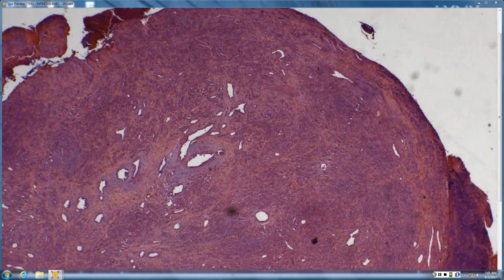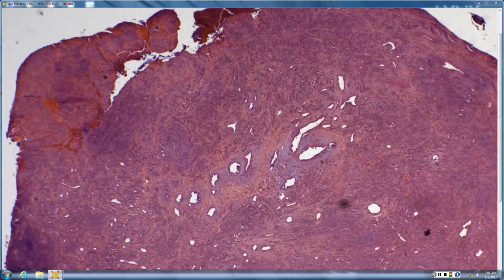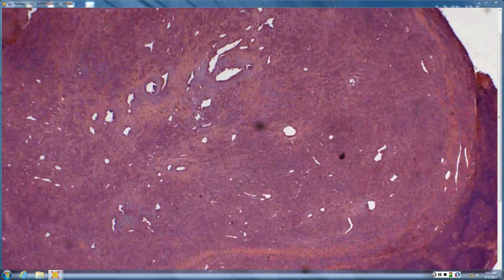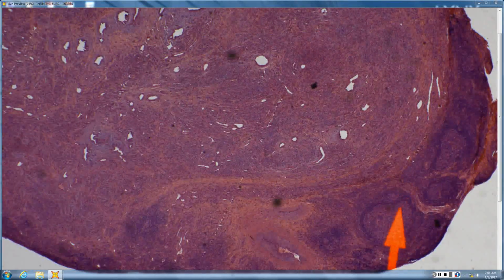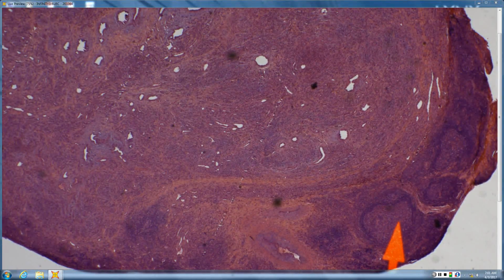So number 6, this one is ALHE, or angiolymphoid hyperplasia with eosinophils. And again, from scan, you can hopefully pick up that there are some lymphoid follicles over here with actual germinal center formation. So that almost looks like lymph node. I mean, it's just this lymphoid proliferation, but it's normal appearing, meaning it has normal architecture and, again, normal germinal center appearance and everything. So it looks normal. It's just more this reactive lymphoid hyperplasia.